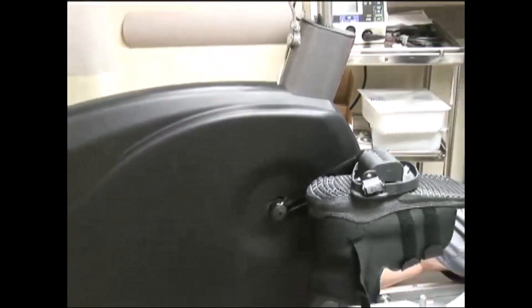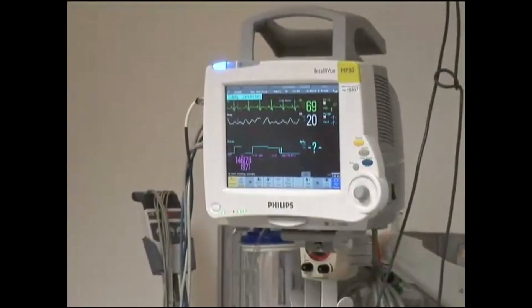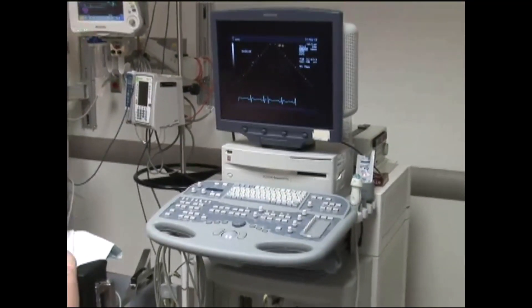Before the patient arrives, the healthcare providers perform a routine check of the equipment to ensure that it is in safe working order. This includes making sure the stress echo equipment is in a locked position, the monitoring equipment is functional, and a resuscitation cart is stocked and readily available.